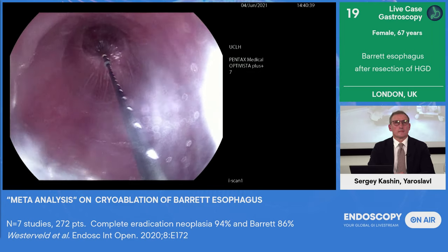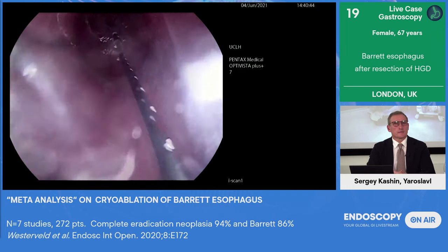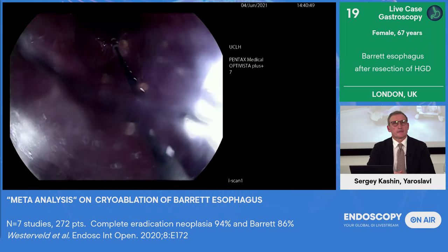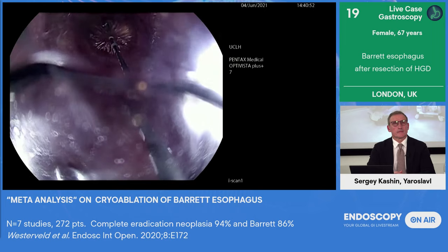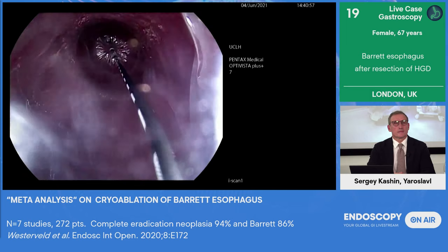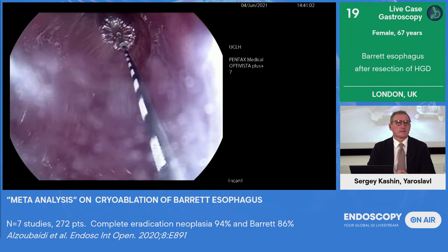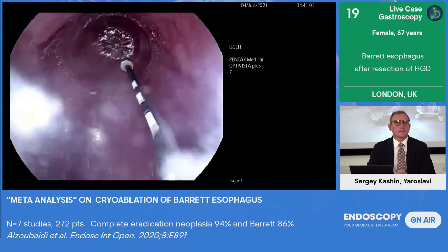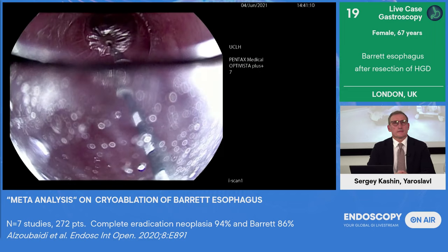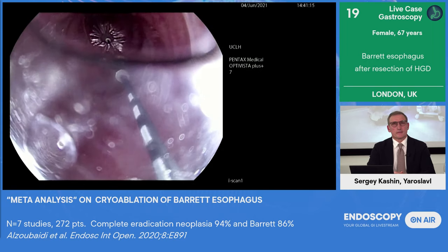And this gives you the ability to follow the device round in terms of where you're going to deliver your cryo spray. So not only can I move the device clockwise and anti-clockwise as I'm doing here, ladies and gentlemen, but I can also begin to move it in the vertical axis. So I can bring it towards me like I am here, and then I can take it away from me, which allows me to then treat areas that are at the oral end and at the anal end.